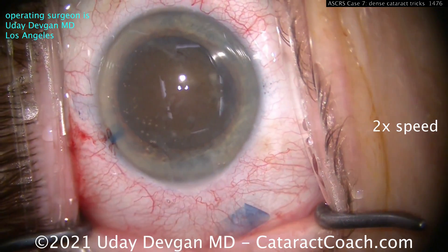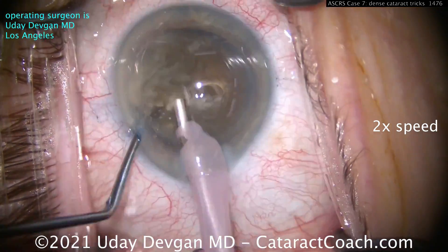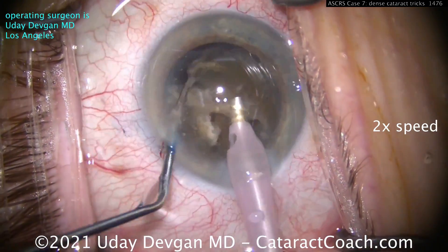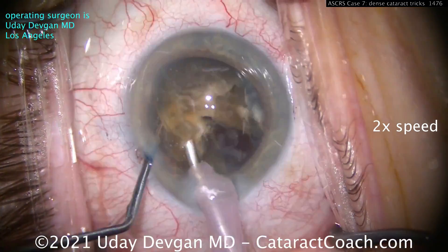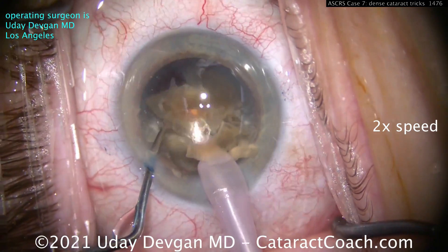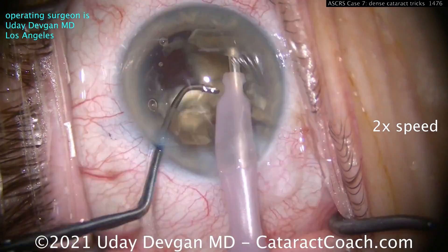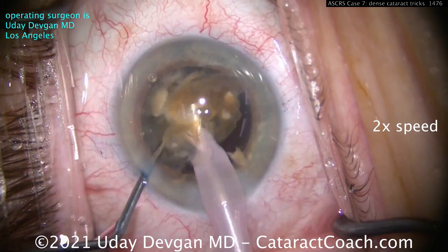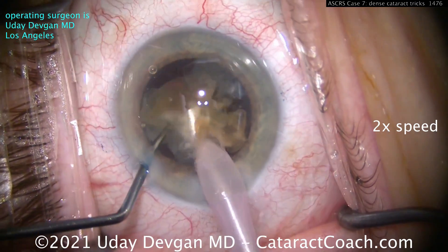Get that nucleus partially prolapsed out of the capsular bag, with plenty of viscoelastic to coat the endothelium, and get that chopper behind the posterior plate. The reason I tilt the nucleus partially out of the capsular bag is I want to trap the nucleus between my chopper and the phaco probe so I can exert more force. I don't want to rely only on the vacuum-holding power — that's not going to be enough. I want to trap that nucleus so I can really exert the power to break that posterior plate, that rubberiness, the fibrous part of it, and get this cataract resolved pretty easily.